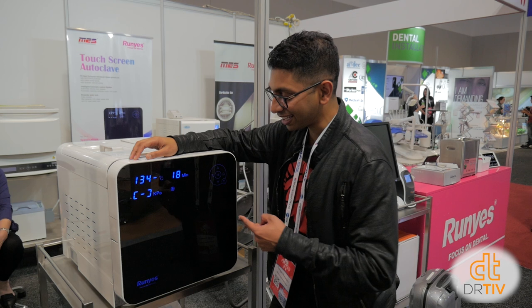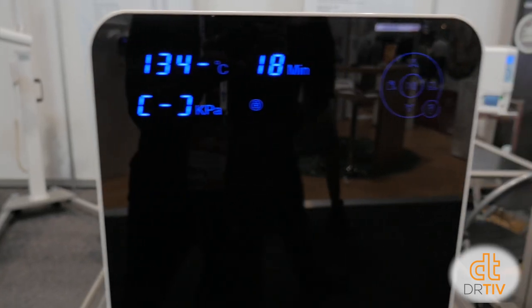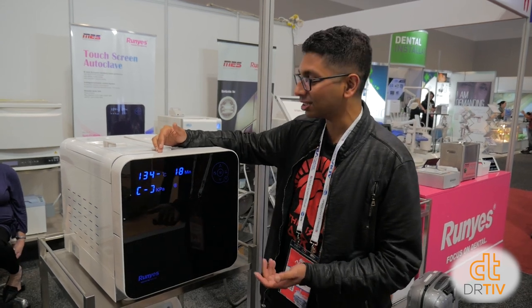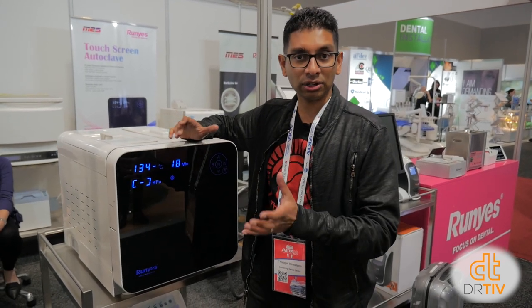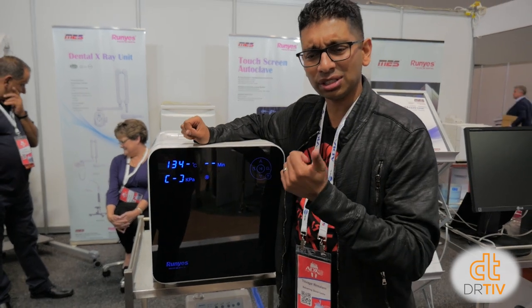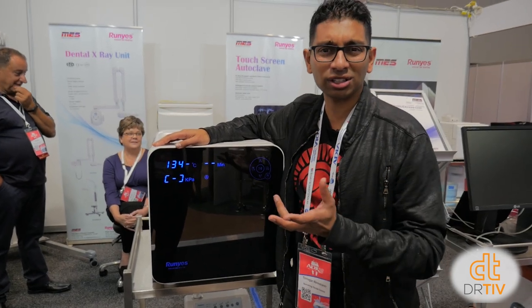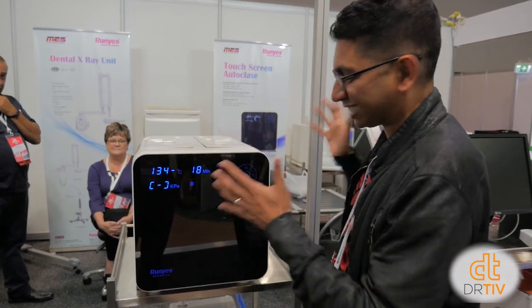I was walking by the stands and I saw this thing and had to find out what it was — it looks sexy. It's a touchscreen autoclave where the whole front is a touch screen. It's probably Runyes — MES in Australia sells it. It's about $7,000 brand new. Cycle times are somewhere between 30 to 40 minutes depending on starting temperature. It's all touch screen, 22 litres, fits a few trays. Even though it's made in China, a lot of the components are made in Japan. The company says servicing costs are low — about $600 a year, and if a vacuum pump fails, about $800.